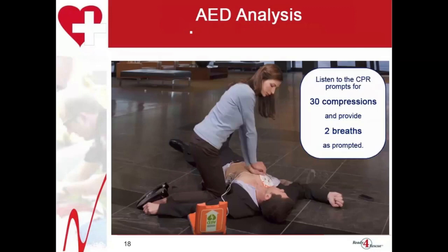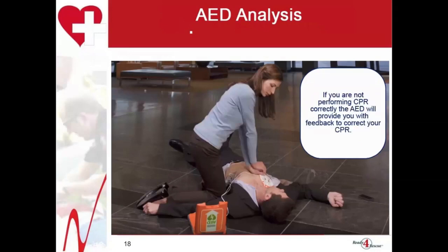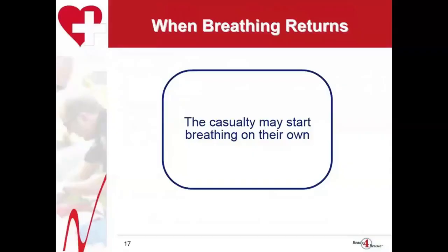Listen to the CPR prompts for 30 compressions and provide 2 breaths as prompted. Continue listening to the AED prompts during the rescue or until EMS arrives and takes over the rescue. If you're not performing CPR correctly, the AED will provide you with feedback to correct your CPR.